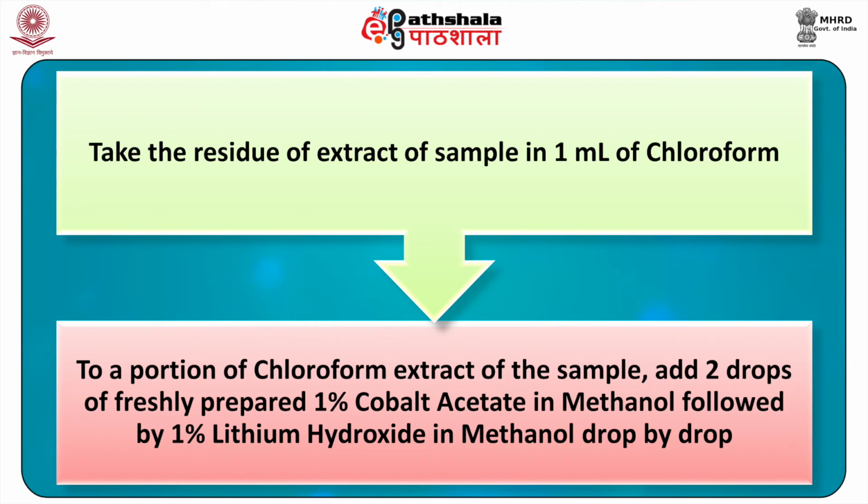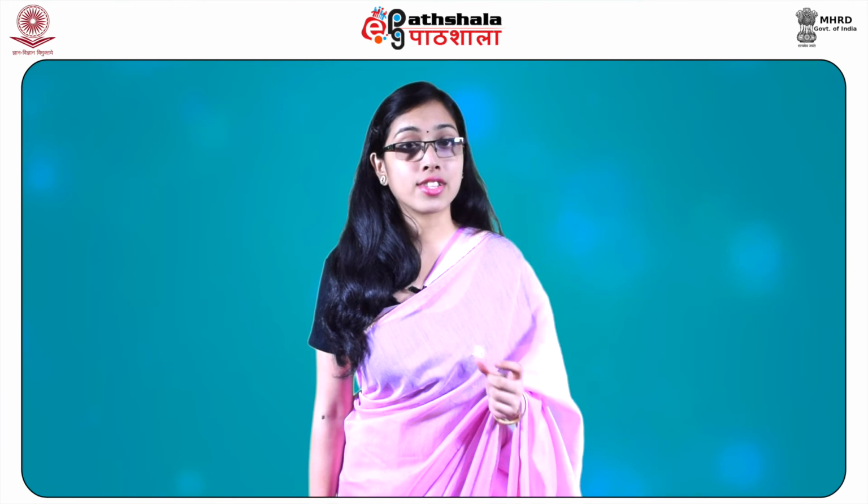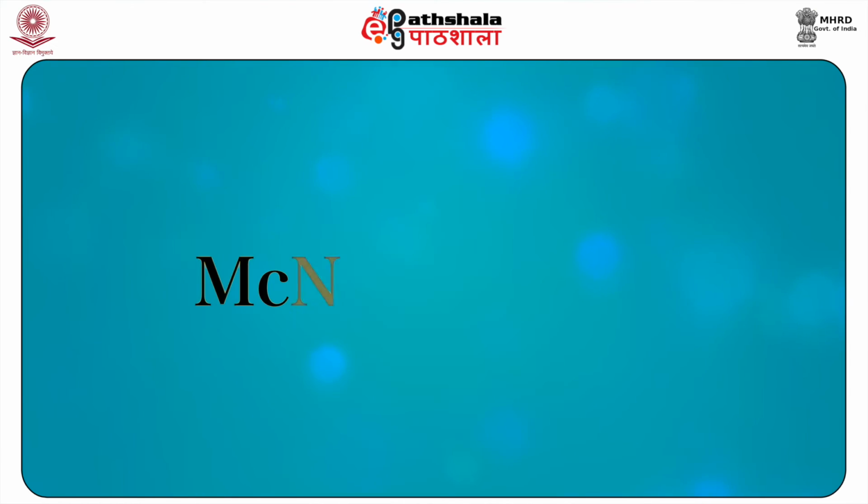In method 2, the residue of the extract of the sample is taken in 1 ml of chloroform. To a portion of the chloroform extract of the sample, 2 drops of freshly prepared 1% cobalt acetate in methanol is added, followed by 1% lithium hydroxide in methanol dropwise. A blue ring at the junction indicates the presence of barbiturates.